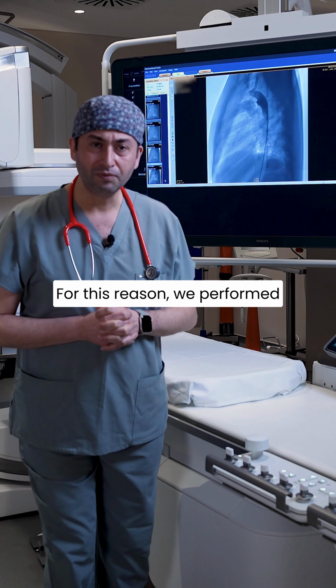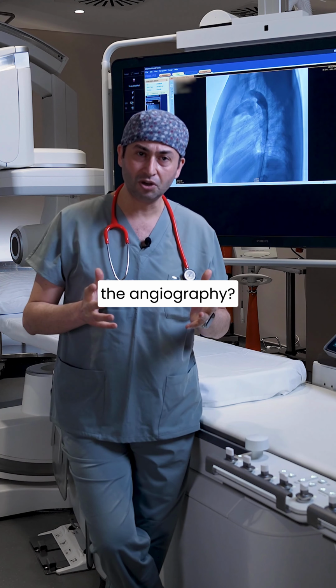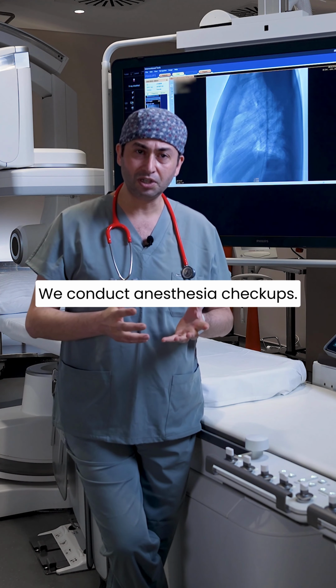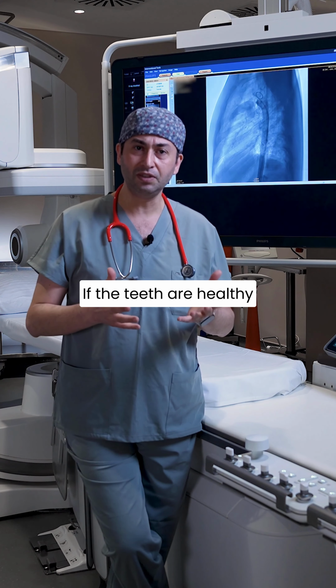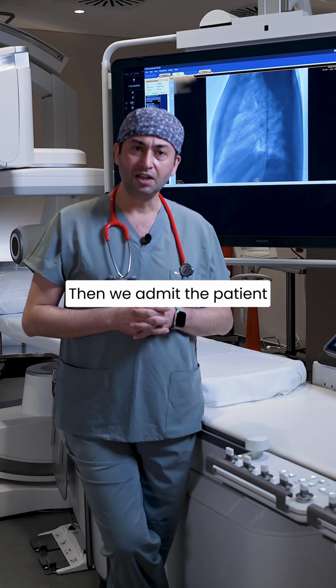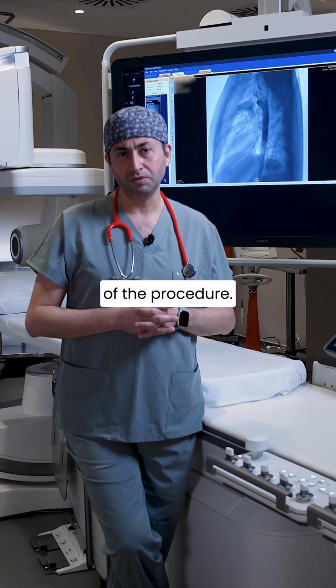For this reason, we performed an angiography on a patient who was referred to us. How do we perform the angiography? We see our patients 1 week in advance. We conduct anesthesia checkups. We check their teeth. If the teeth are healthy and clean, the patient is considered suitable for the procedure. Then, we admit the patient to the hospital either the day before or on the morning of the procedure.